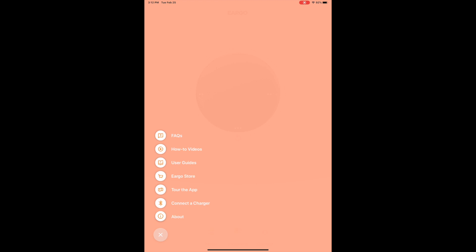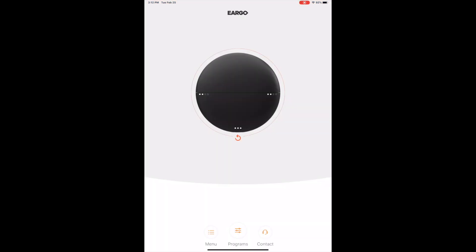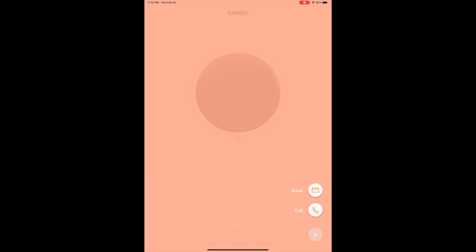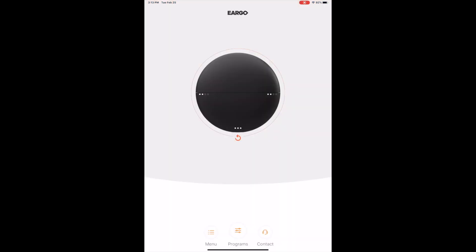So we close that out and we really get into, let's go into contact really quick so we can just get that out of the way. Contact is pretty simple, gives you the ability to either email or call Ergo directly from the app, which is a nice touch for you to get in contact with them should you need them, perhaps for an audiologist for help or whatnot.